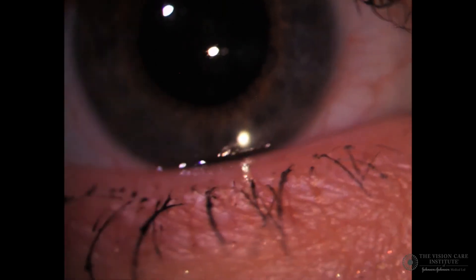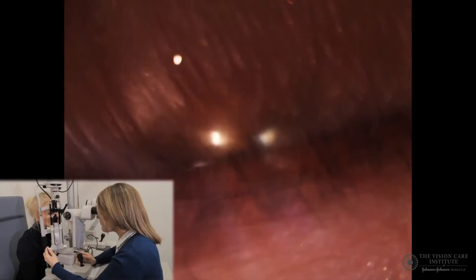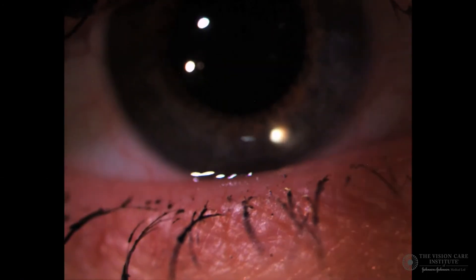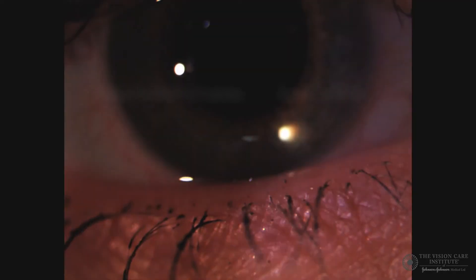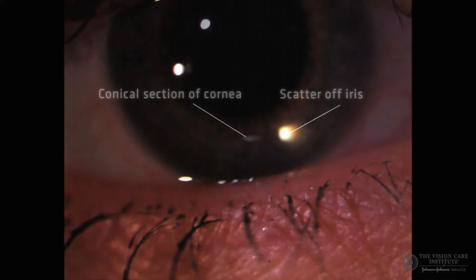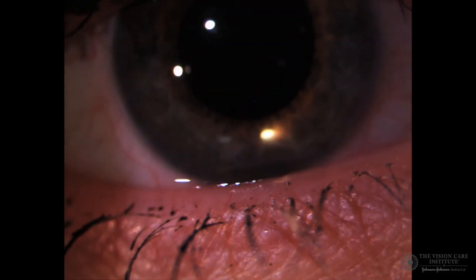As we increase the angle between the observation and illumination system, we will get the conical section off the cornea on the left and the scatter off the iris on the right. The scatter will be of low contrast, so to make it more visible, we need to switch off the ambient illumination.